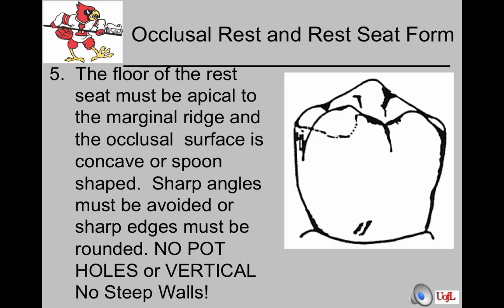The floor of the rest seat must be apical to the marginal ridge, and the occlusal surface is concave or spoon-shaped. Sharp angles must be avoided, or sharp edges must be rounded. You don't want to have any potholes or any vertical steep walls.